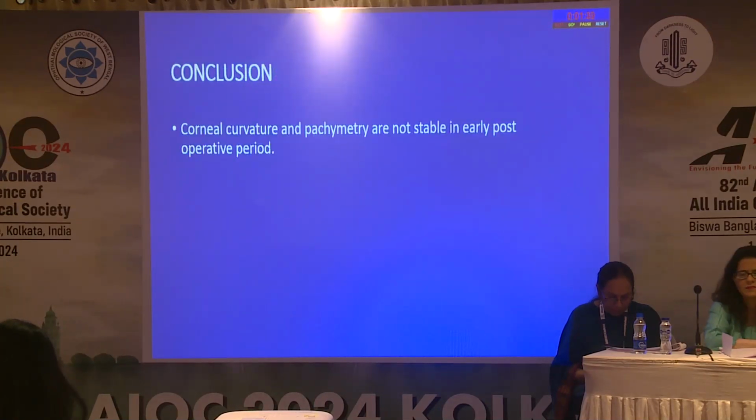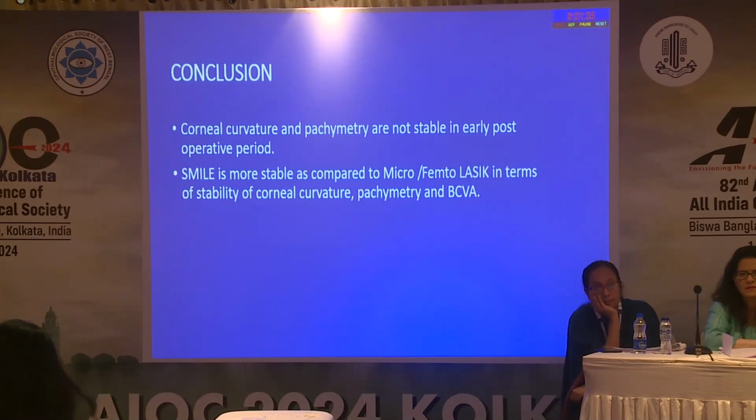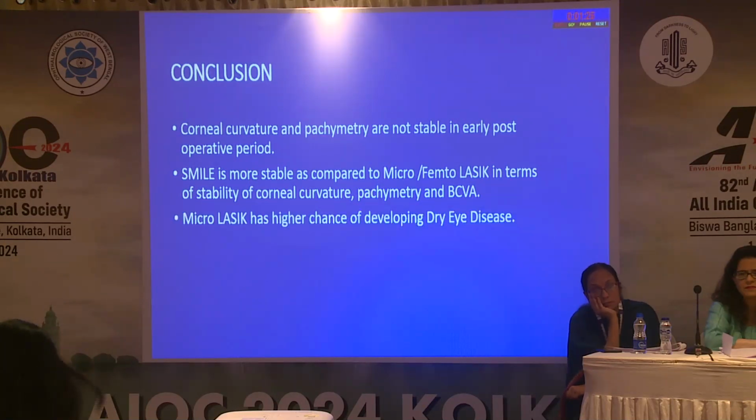So to conclude, the corneal curvature and pachymetry are not stable in the early post-operative period, and SMILE is more stable as compared to microLASIK and femtoLASIK in terms of stability of corneal curvature, pachymetry, and BCVA in our study of 3 months. And microLASIK has a higher chance of developing dry eye disease.